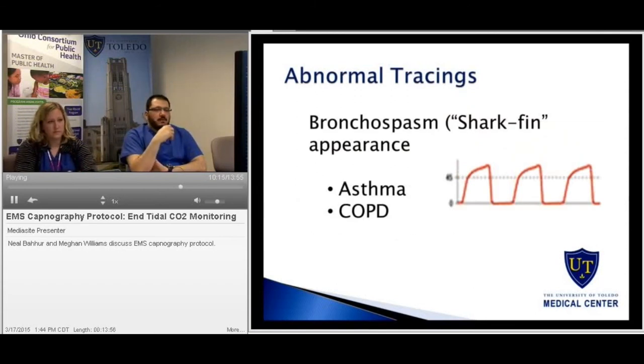Here we have Megan's favorite waveform, the shark fin. This simply demonstrates that the patient is retaining more CO2 than they should, and this is common in conditions such as an asthma exacerbation or COPD.